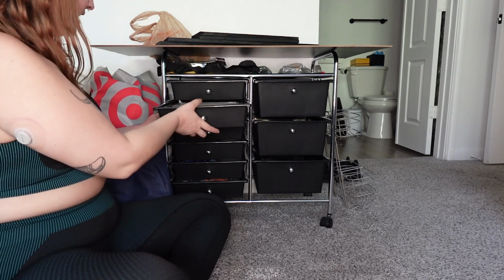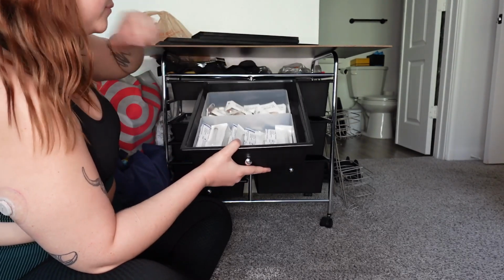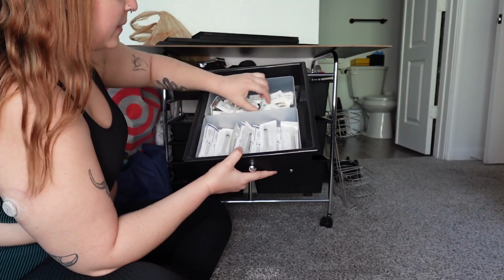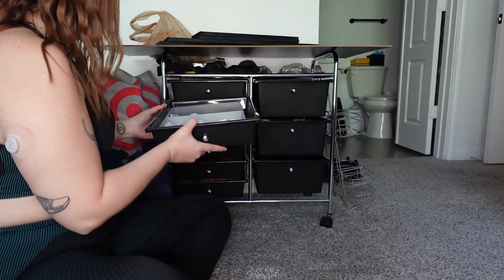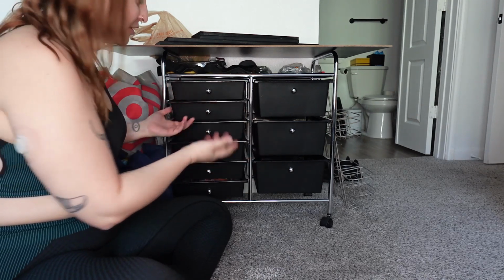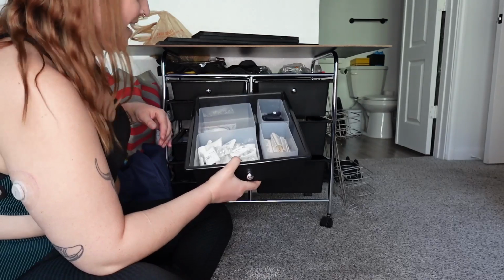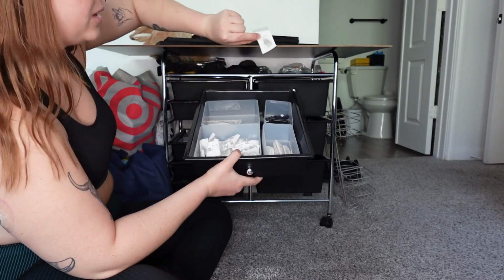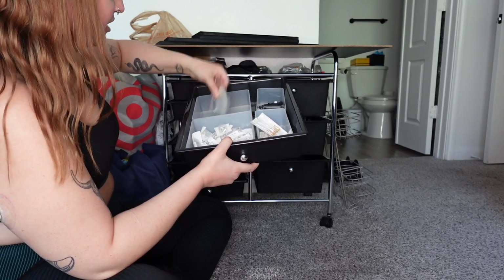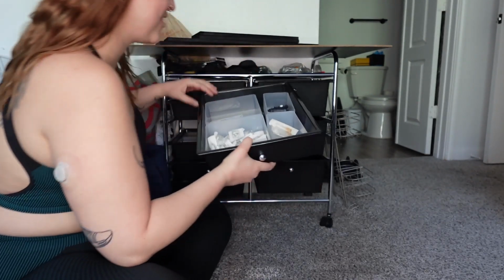And then the next one, I have cute little organizers that I got from the At Home store. We have our little syringes, and then we have the iLet cartridges. I don't know why I chose to take it out instead of showing you guys differently. It's beyond me. I could have done ASMR with this, but I chose not to. I have my little iLet connectors, the needles for the syringes. I have literally one left, so I need more. My Dexcom patches for my Dexcom G7.